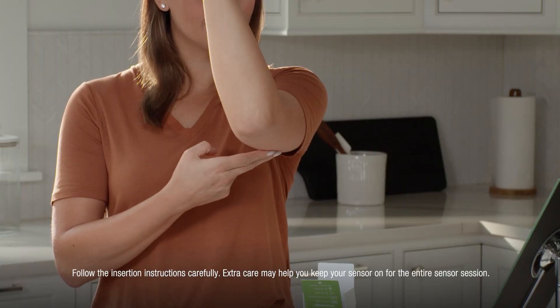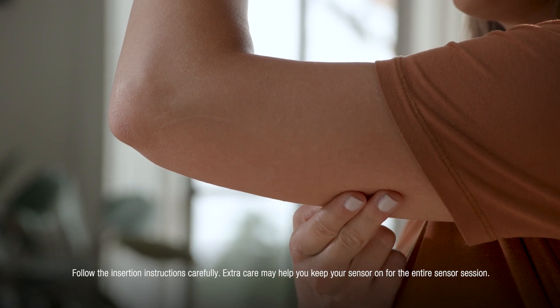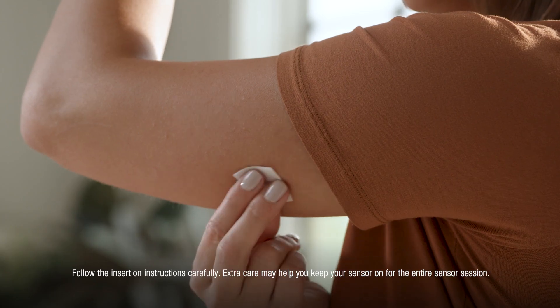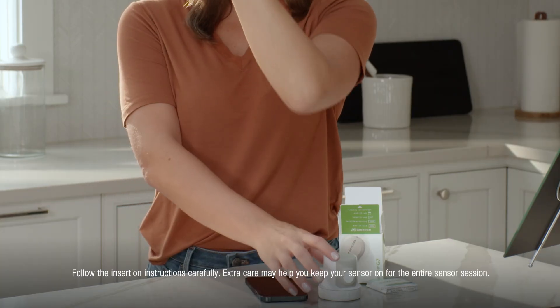Choose a site with enough fat to avoid muscle, and a site that is not likely to get bumped or pushed. Clean your site with an alcohol wipe and let it dry. Grab your applicator and unscrew the cap.